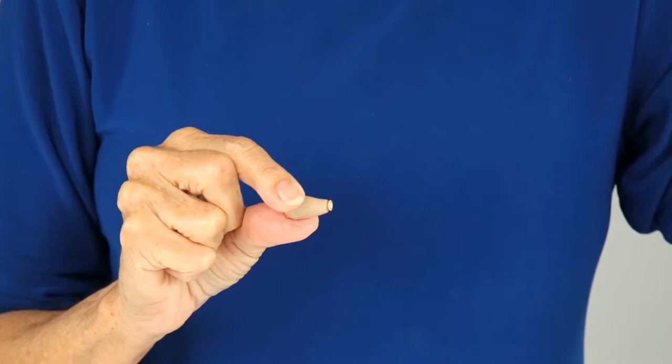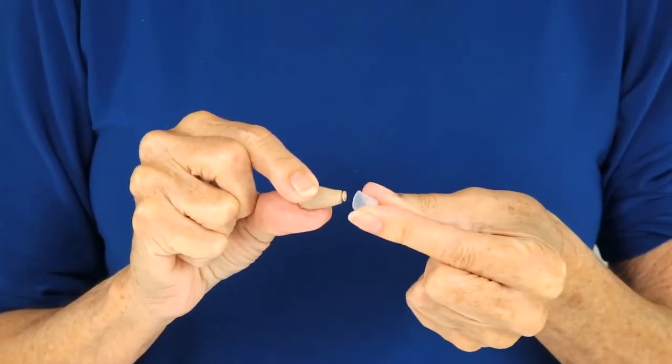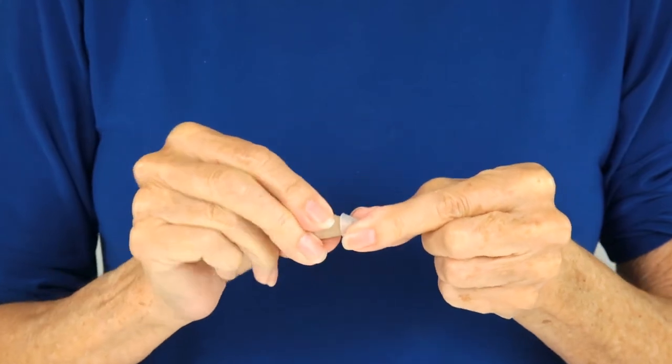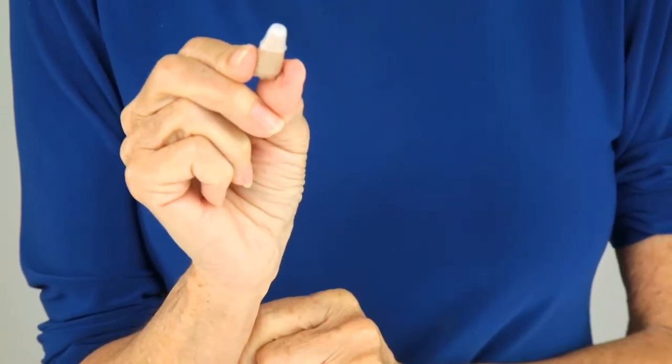To put on the new cap, fit the wide end of the silicone tip over the open end of the hearing amp. Press the cap down to ensure a secure fit before fitting the amp into your ear.